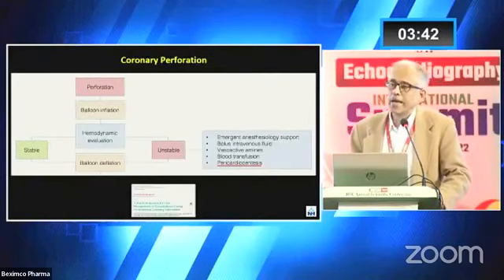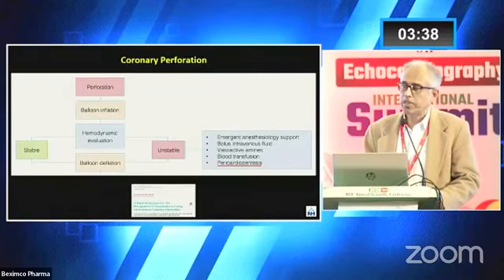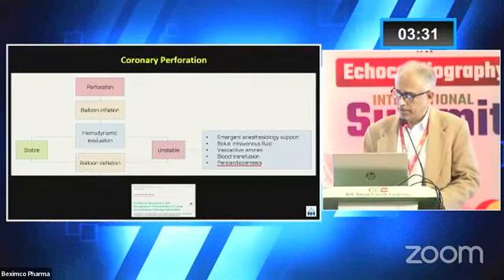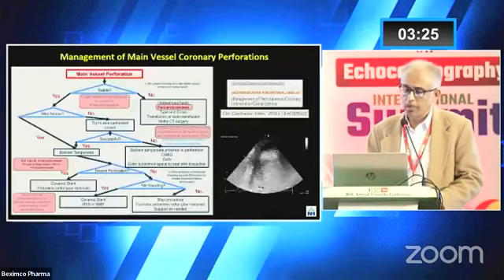Now, what are the scenarios? What can go wrong? One is coronary perforation. This is again with stiff wires, or dilating the balloon, or oversized stenting, or any problems with the arterial wall. This can happen, and again pericardiocentesis here. So this is where echo can help.